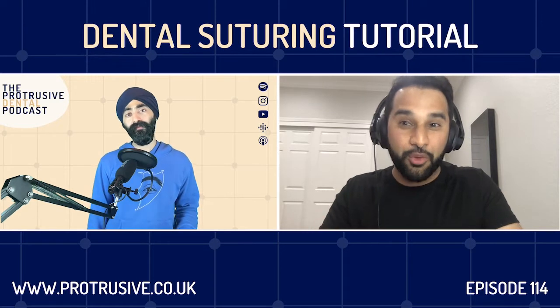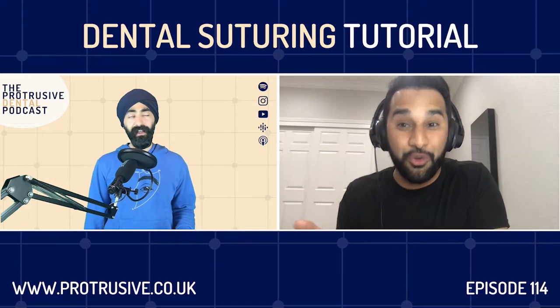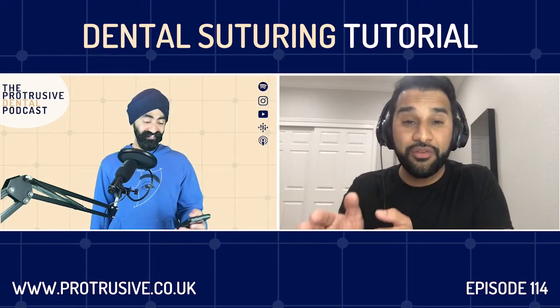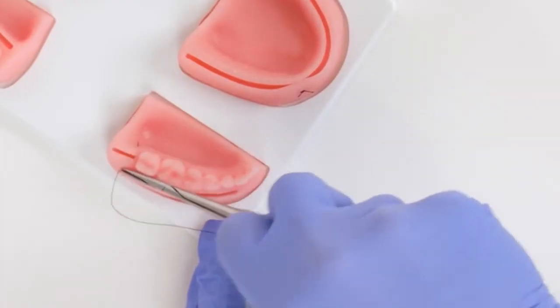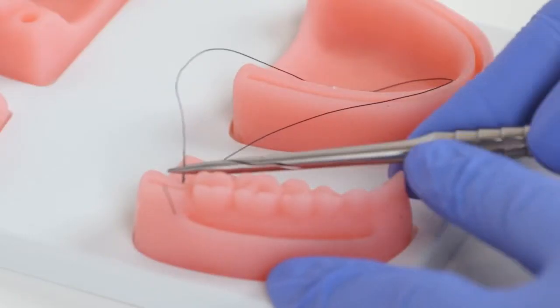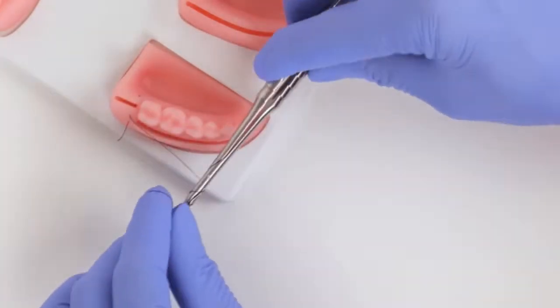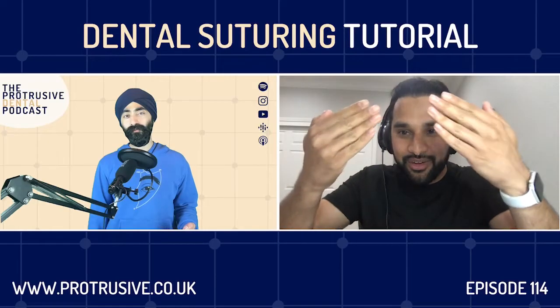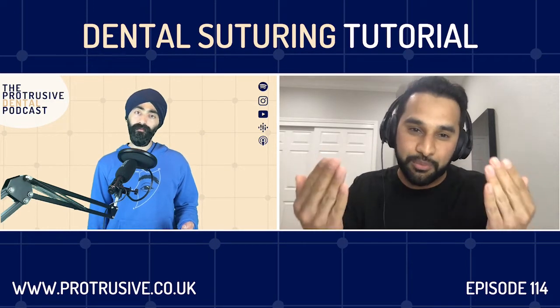But is that necessarily what you want when you're grafting a site, to choke the blood supply? That's what you don't want. I love the way of saying it, choking. It's a perfect term to use, actually. The vertical mattress takes the horizontal mattress, and because now you're looking at a more apical and coronal entry point, it does the same thing but doesn't choke the blood supply. And say you're trying to be really delicate and bring a papilla up together, the last thing you want to do is choke the blood supply. You could use a vertical mattress to bring the papilla up.